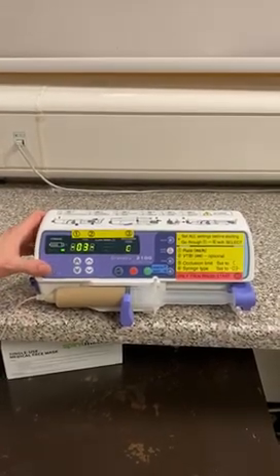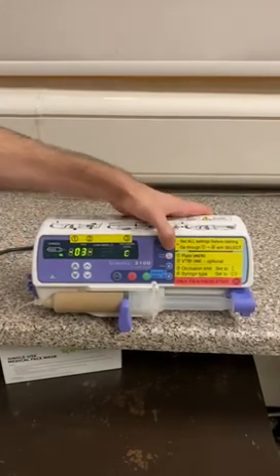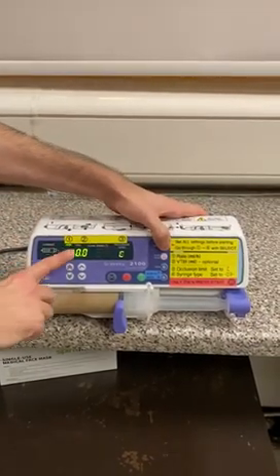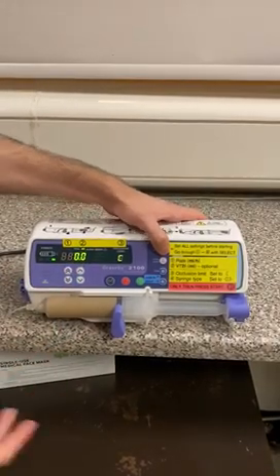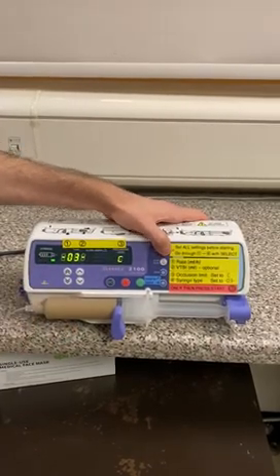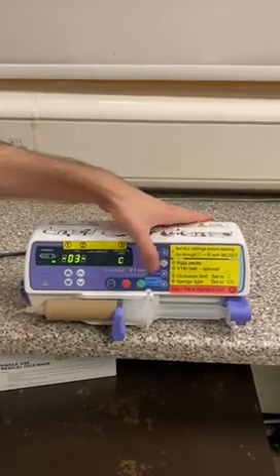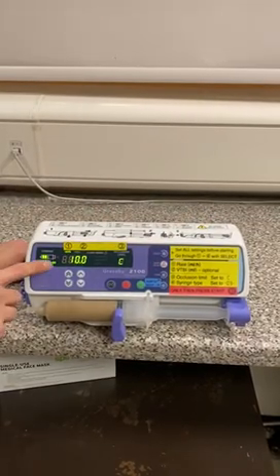We've done all the setting up. All we should do is check that the settings are correct — press select to cycle through those four settings again. Mils per hour is 10, which is good. Mils is 0 because it's a continuous infusion. Occlusion is C, and our syringe type is 3. All we need to do now is press green for go, and our infusion has started — you can see that it's running now.